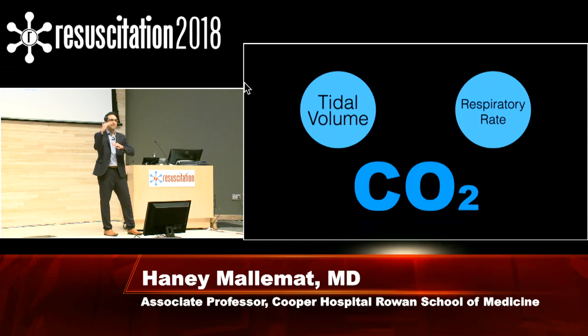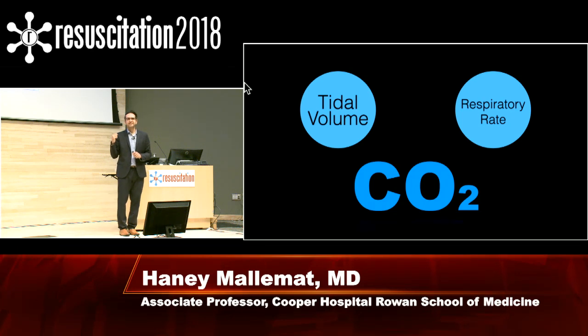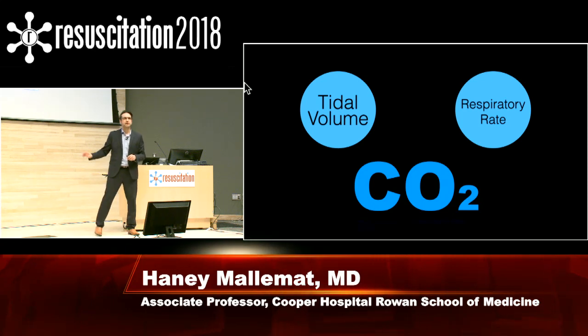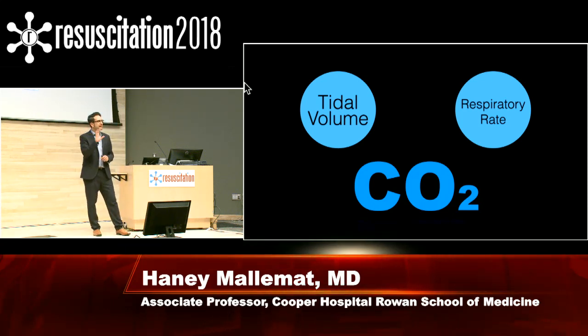But if you have that patient who also has a hypoxic component, again, take that pneumonia example, that person that's tiring out, you can provide a little bit of support, some EPAP at the end, to provide some support for that lack of oxygenation. So if the person is the COPD patient, all they need is a delta. They don't need any EPAP. They could be 10 over 0, right? 10 of IPAP, 0 of EPAP. But if they have some hypoxic component, you want to titrate the EPAP. And that's why it's so important to understand this stuff from the building block perspective, because every patient that comes in is going to have a different disease. It's not just about putting them on BiPAP. It's knowing how to titrate each individual variable.